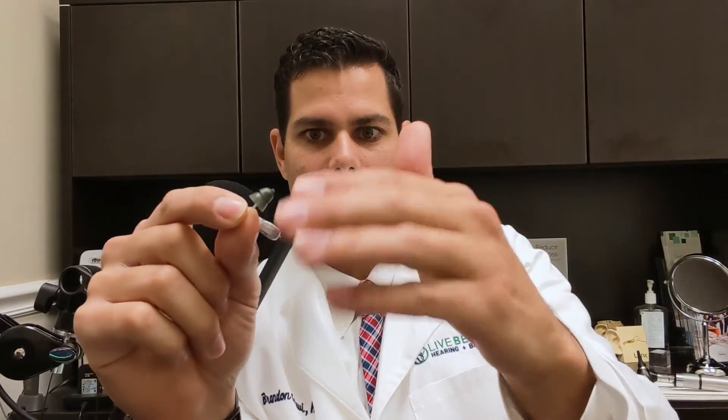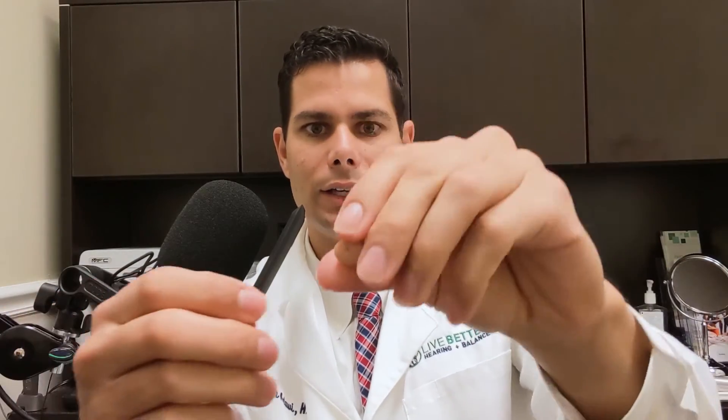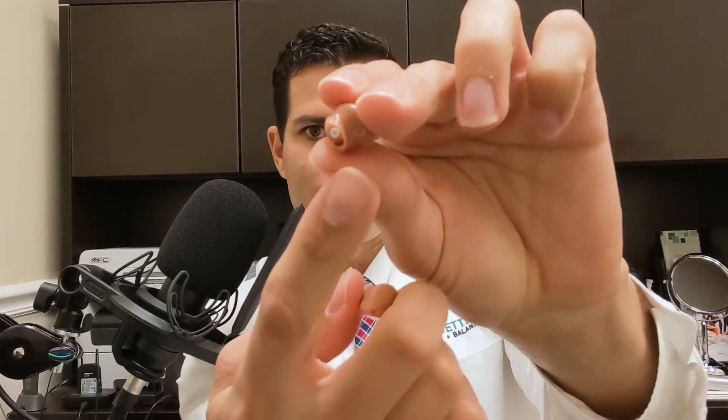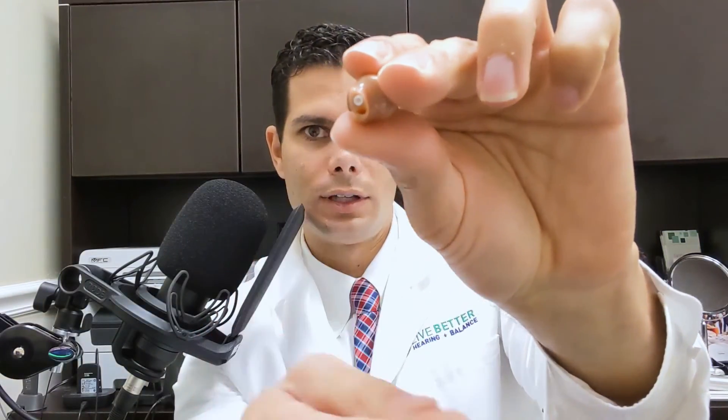Also, you'll get less feedback because the earbud is not allowing sound to come out of the ear canal and be reamplified by the microphone of the hearing aid. Another alternative is if you had a hearing aid that's in the canal, having it built with a smaller vent. The vent is that hole. Shrinking the size of the vent allows less sound to escape the ear canal and reduces feedback potential.